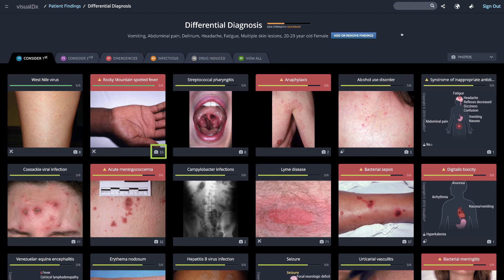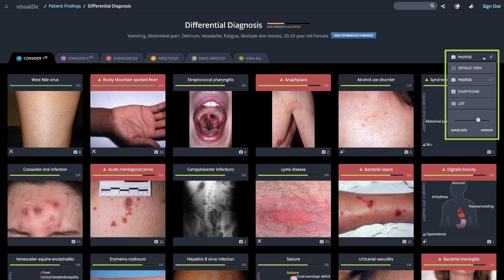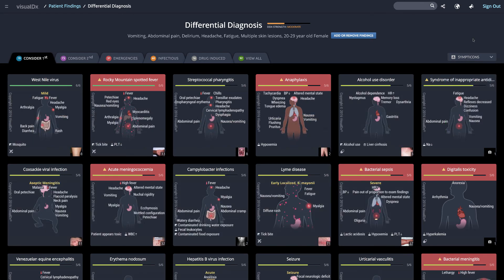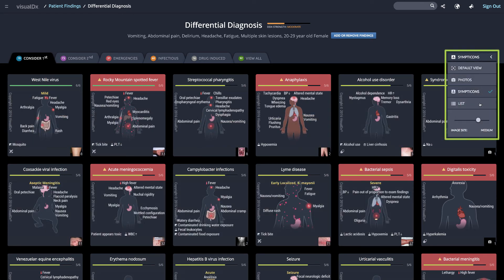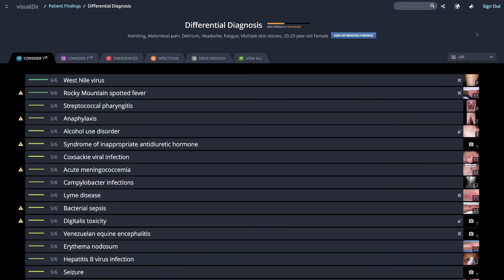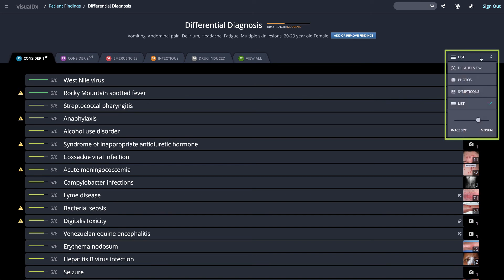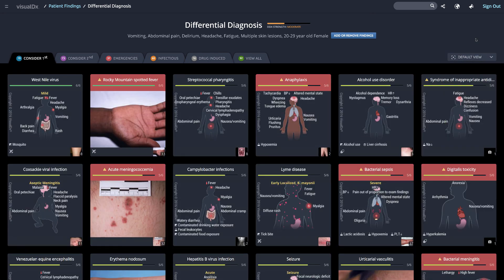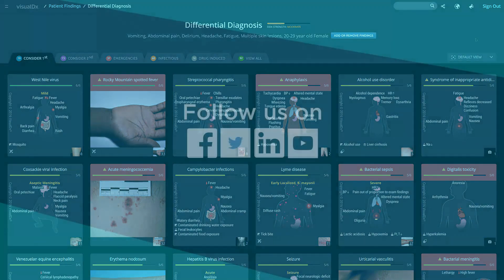There are 33 images connected to Rocky Mountain spotted fever. You can view your differential in different formats — we're in photo view now; this is the symptom-con view, and here's how the list view is displayed. You can also use the default view to see a mix of images and symptom-cons that best represent each diagnosis. Learn more about diagnosing adverse medication reactions using VisualDX in the video 'Medication Adverse Events.'